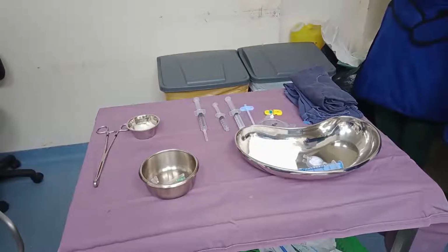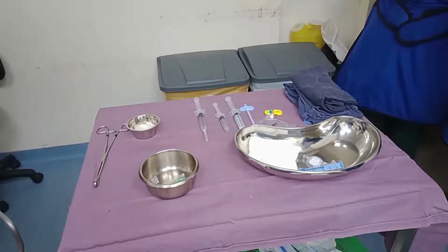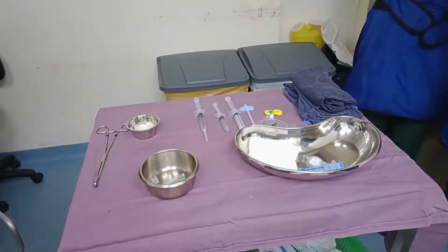The needle being used is a 16-gauge Tuohy needle for caudal epidural. As the procedurist is going to put a catheter down, the Tuohy needle is ideal for this reason. On one side of the trolley, we have 2% chlorhexidine solution in a teapot with a sponge holder. It is kept separated from the rest of the trolley and carefully handled because 2% chlorhexidine contamination can lead to neurological damage if it comes in contact with it. So the needle is kept quite separated from the chlorhexidine.